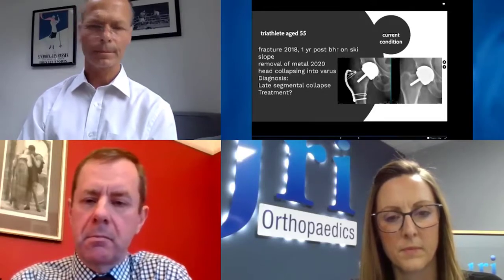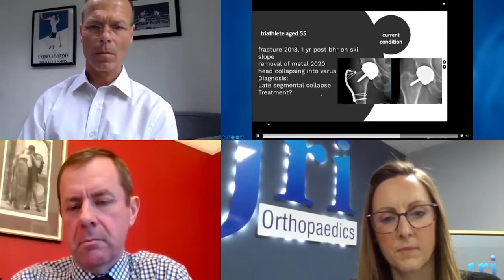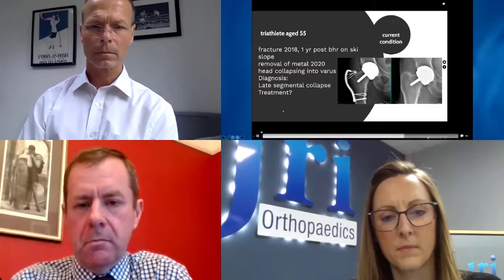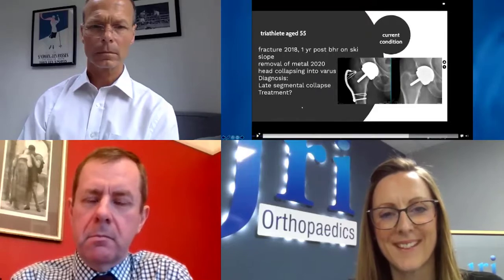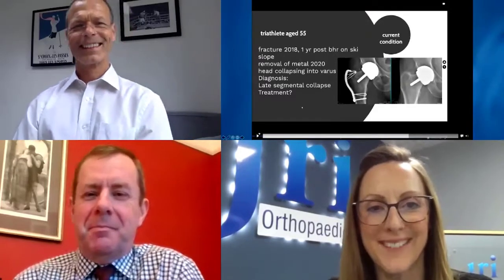So you see the difference in the head at the angle here. The head was collapsing. Late segmental collapse is the diagnosis. What's the treatment option? And again, a little pause for discussion here, I think. Great staging for us. I'll go to you first, Johan.